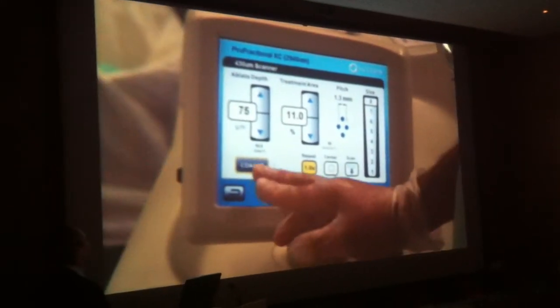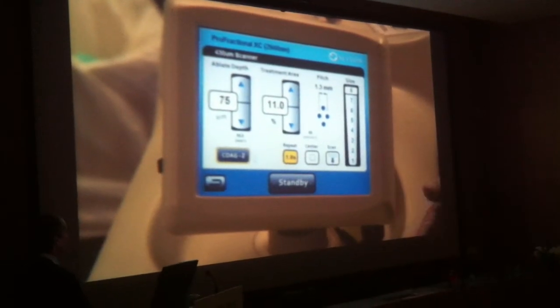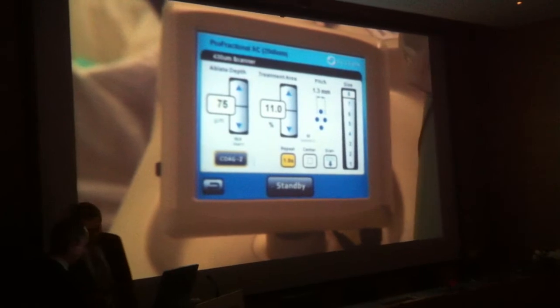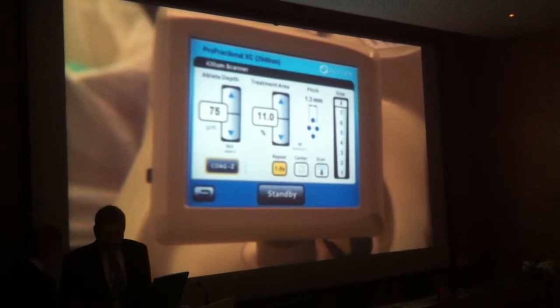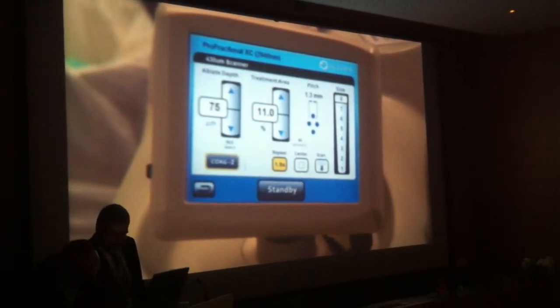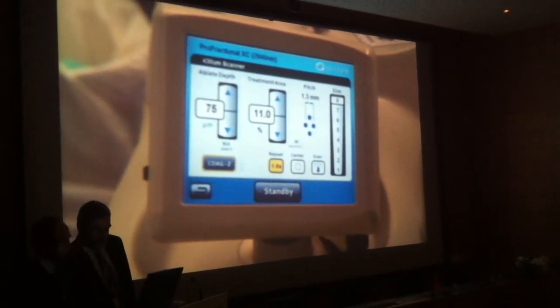And so I was telling you, it's difficult to see an erbium YAG laser with such coagulative power, and this is very meaningful because of two reasons. First, this laser is really powerful. Second, it has actually two lasers in one. One ablates, the other one coagulates. So you have the possibility of customizing the treatment that you want to give in different areas of the same face. This is what you're going to see here.